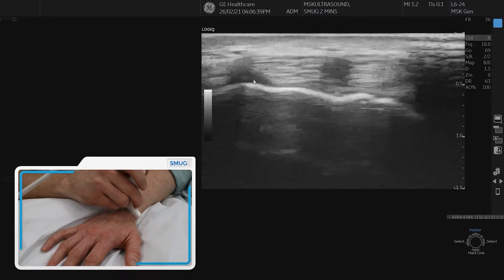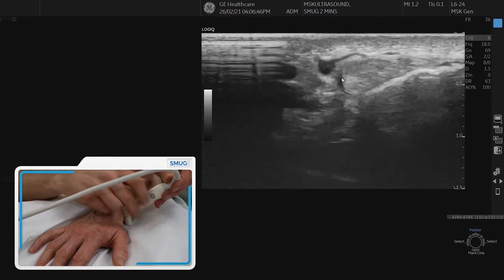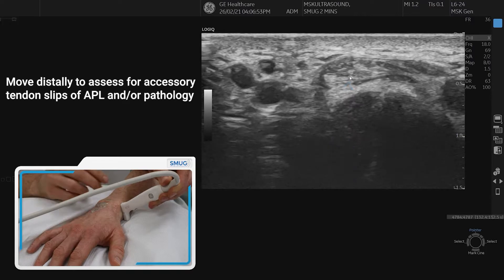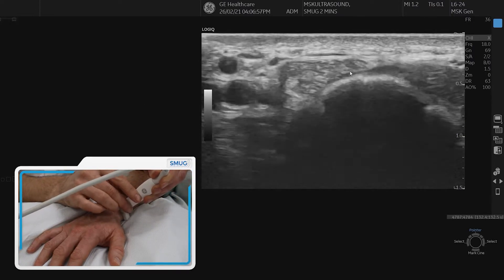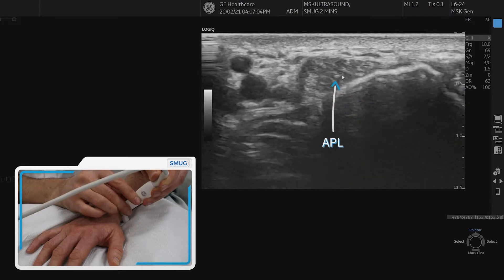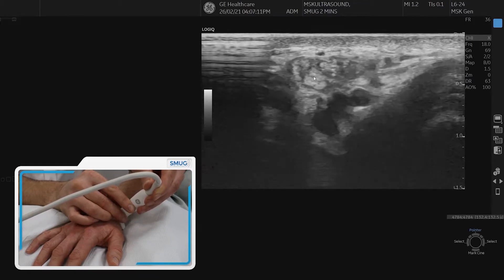If we go round to the radial side of the wrist, this is where we can get quite a few anatomical differences and variations. We can see abductor pollicis longus where the arrow is, and we've also got extensor pollicis brevis — that's the small tendon on the right hand side. You just need to follow up and down. As we go distally you can see that abductor pollicis longus actually has multiple slips, which is not uncommon and something to look out for.